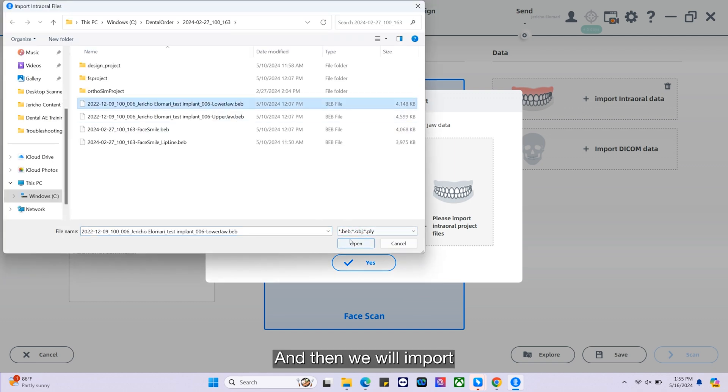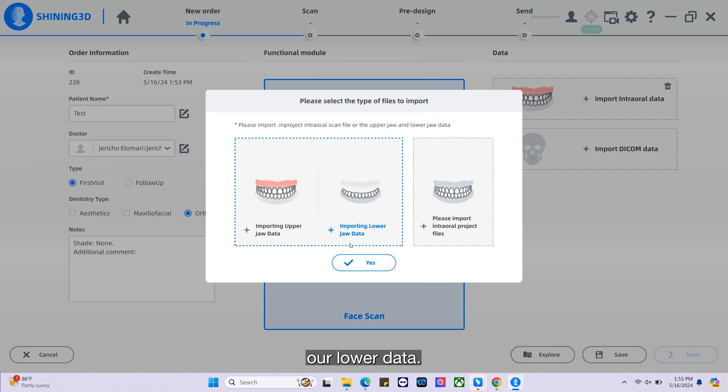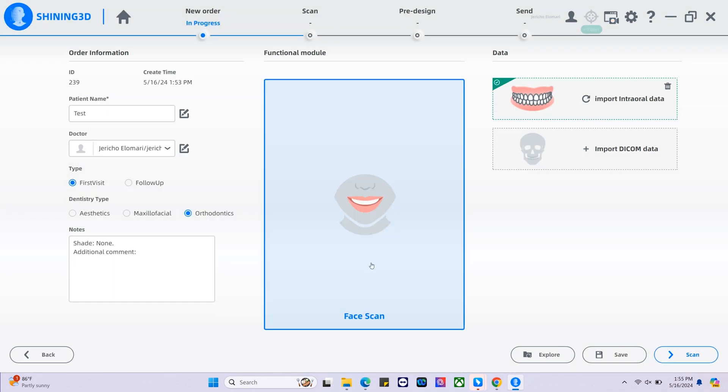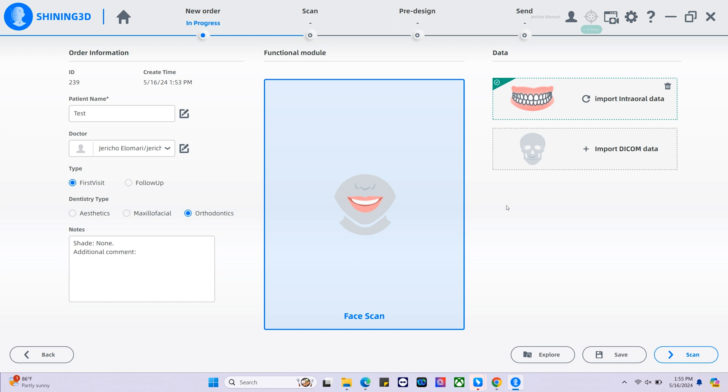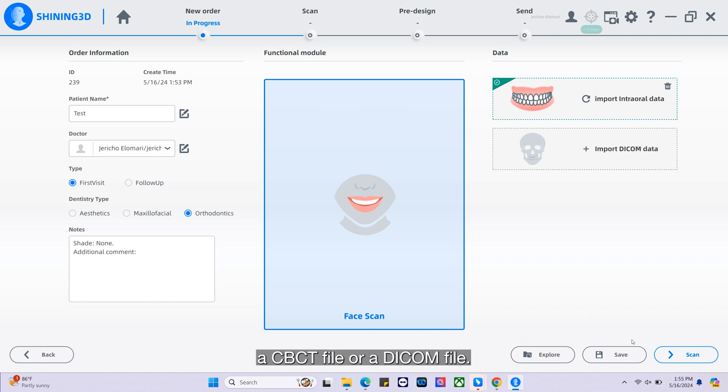And then we will import our lower data and select yes. We also have the option to import a CBCT file or a DICOM file.